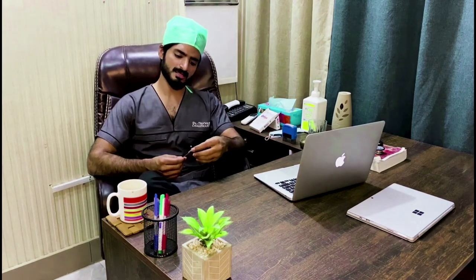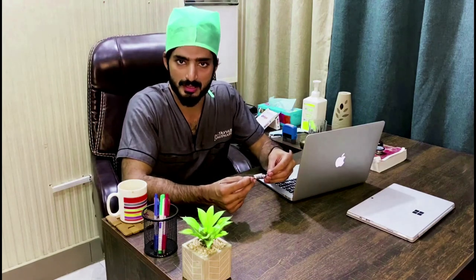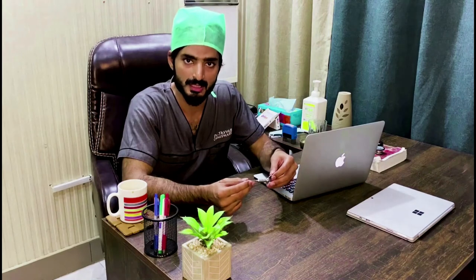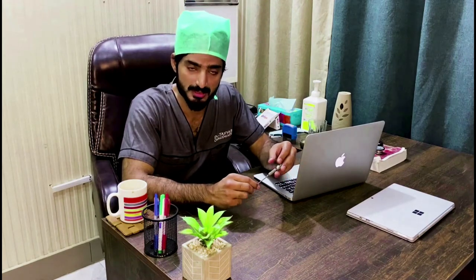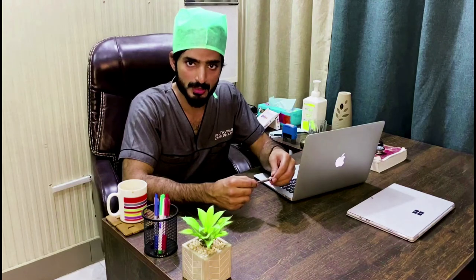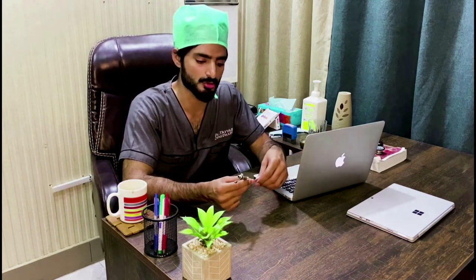Today I will be discussing this very small but very useful tool, that is the laparoscopic Veress needle. The Veress needle was invented in 1932 by a Hungarian internist whose name was Janos Veress. He used to treat tuberculosis patients with the Veress needle by creating pneumothoraces, and that way he used to treat pulmonary tuberculosis. In 1938, the Veress needle became popular, and general surgeons and gynecologists started using it for the purpose of pneumoperitoneum.